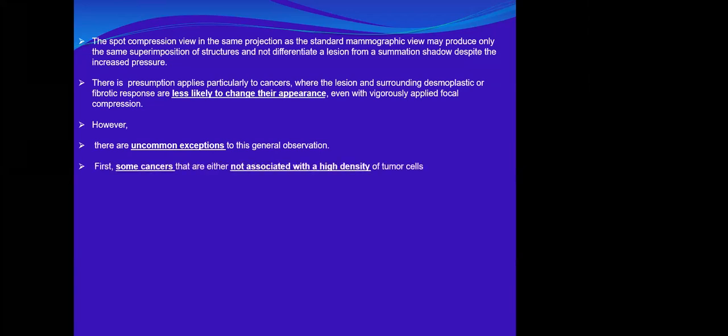Some cancers are not associated with a high density of tumors, so it might become less dense on spot compression and give erroneous impressions.